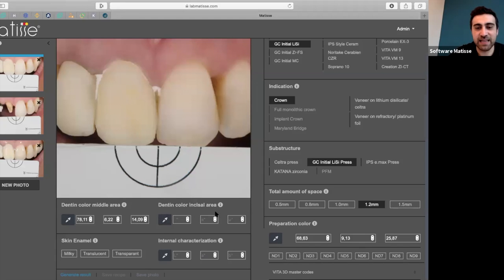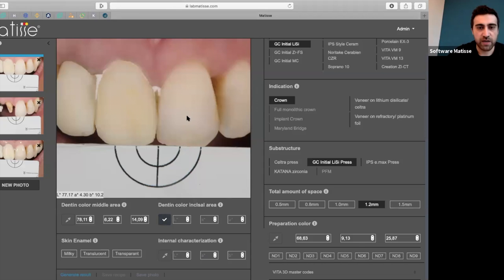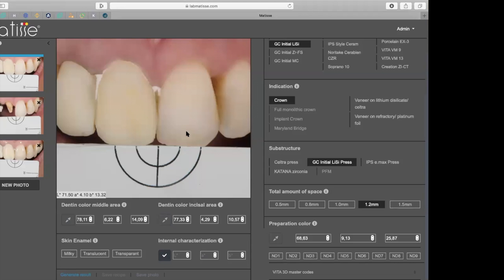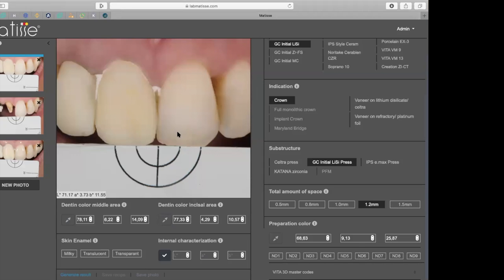So then the dentin color incisal area. I will measure the bright area here. And then we have the internal characterization. So I can measure the secondary dentin or discoloration.